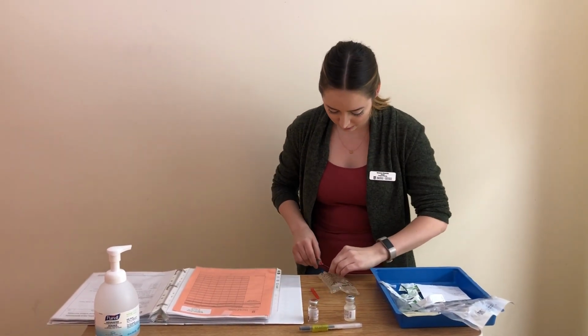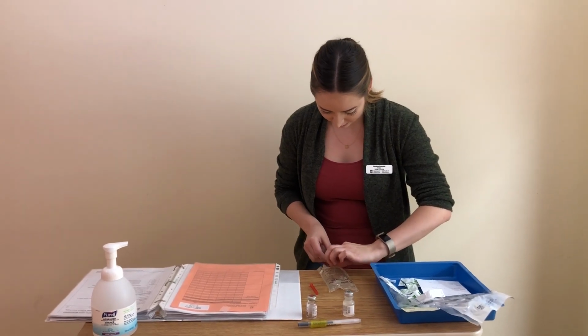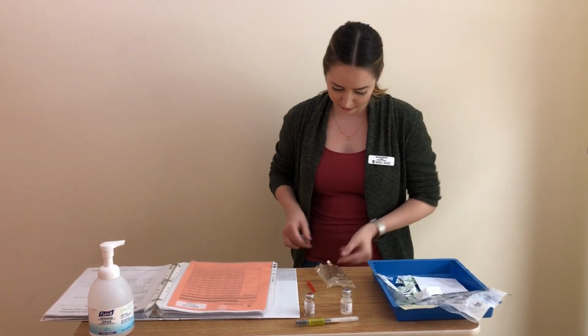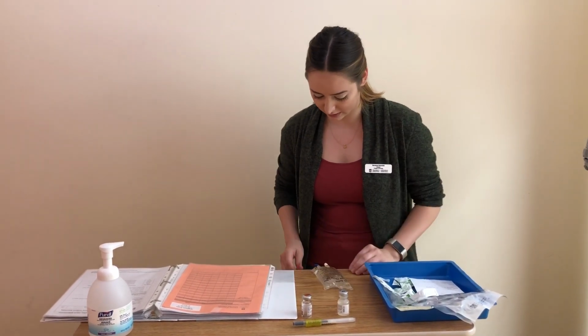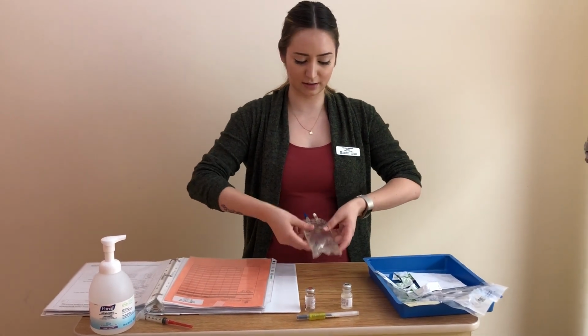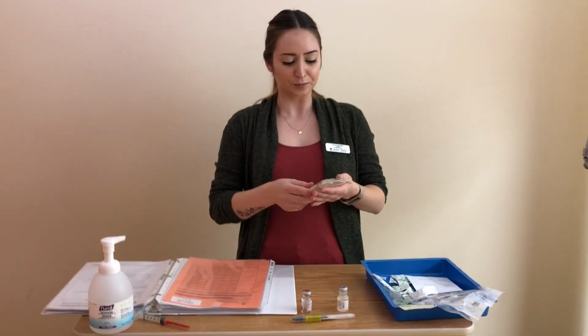And then I will instill the medication into the mini bag. And then you do the third check. And this is done. This can go into the sharps. Now I'll disperse the drug.